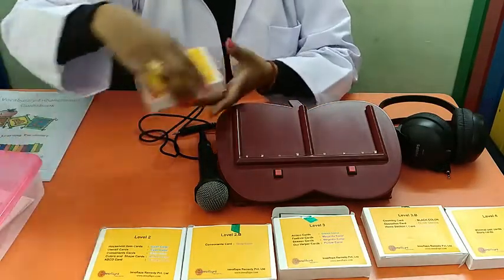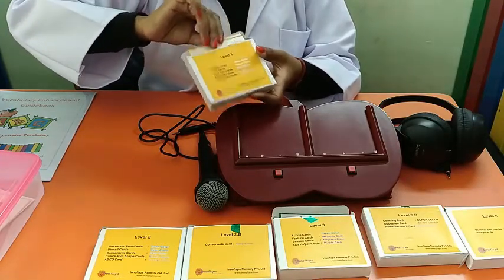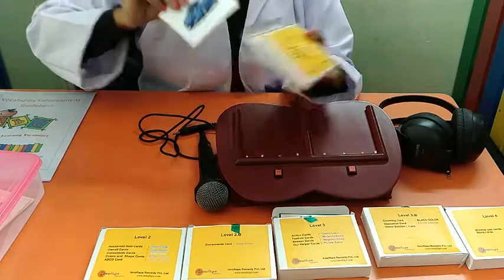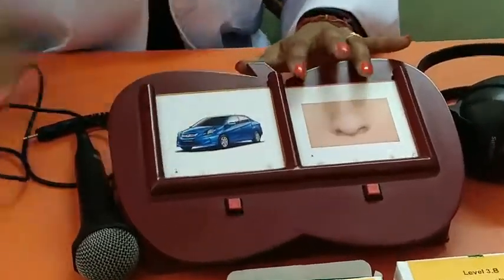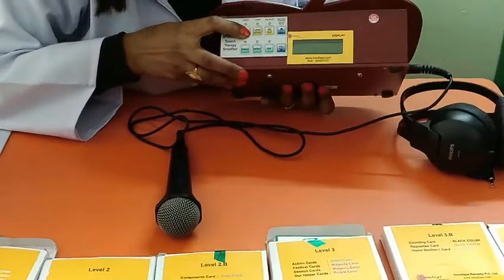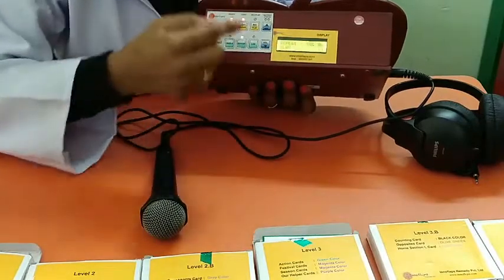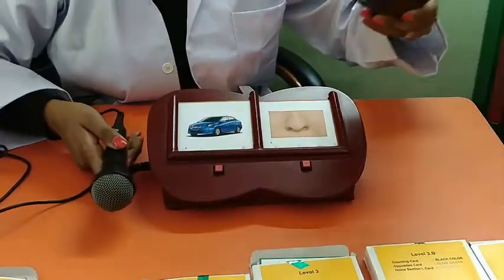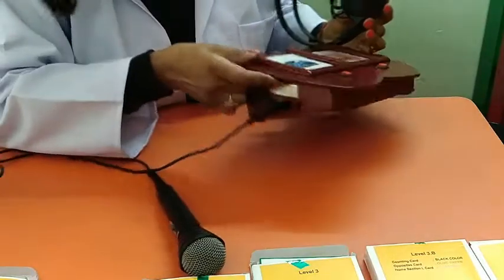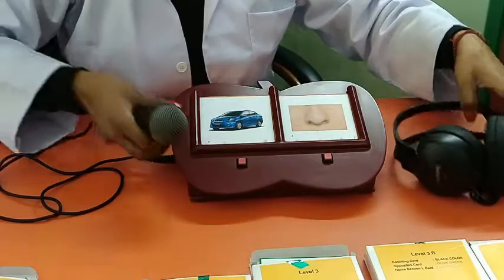For example, if a child comes and speaks a word or doesn't speak words, we can select any cards and place them on the device. We can place two cards and switch on the light of the Speechify device. Once started, we can go to the light mode. Without putting the headphone in the section, you can directly give stimulation through the inbuilt speaker. When talking about light stimulation, first press the light button.